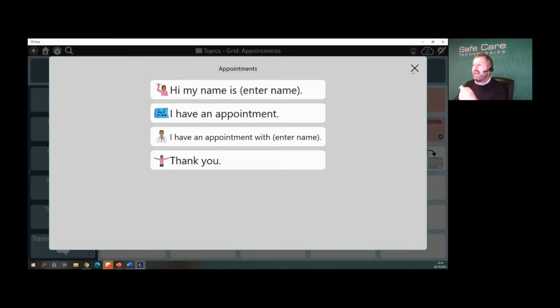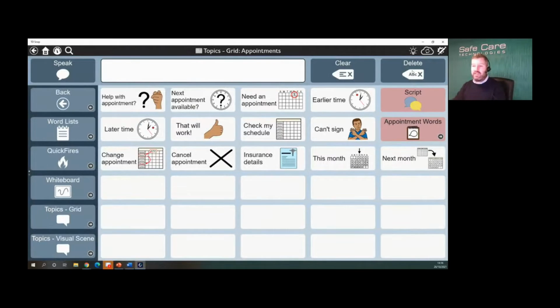So again, it can take away the nervousness of that conversation, and help a person with what you might call performance anxiety of using the device in front of maybe a stranger, that they can have that script ready for having that conversation pre-prepared. So again, you might be going into the shop and you might want to ask where's the newspapers, or where can I find the fruit, etc. And you'll have those ready within a script.